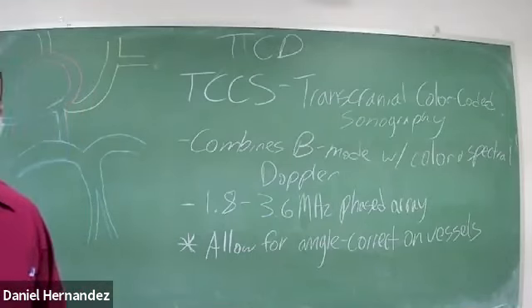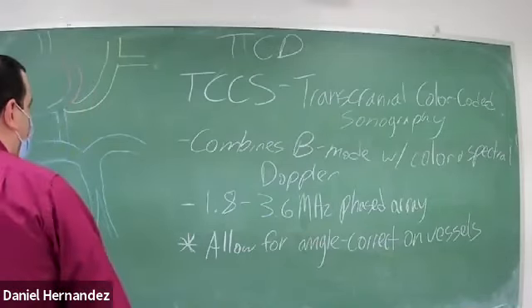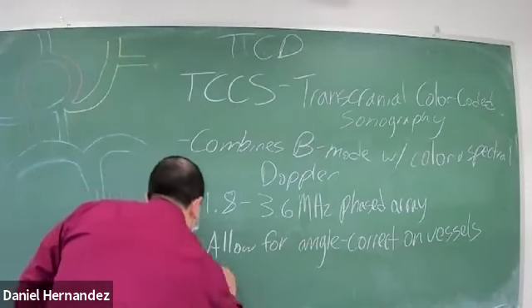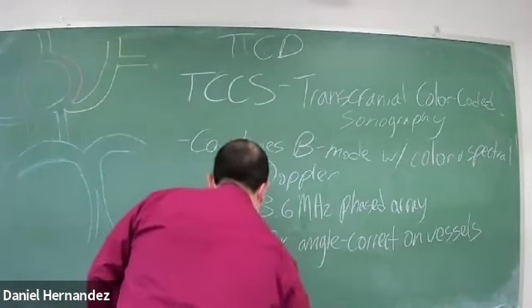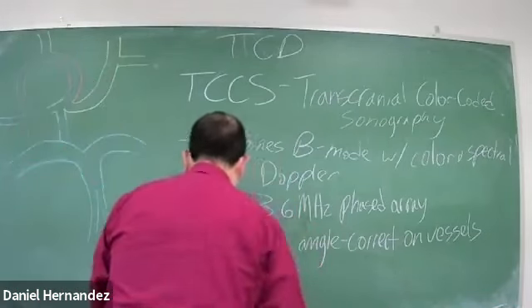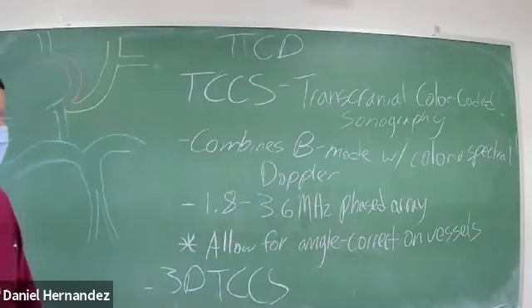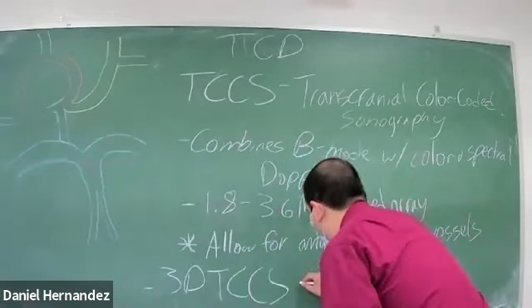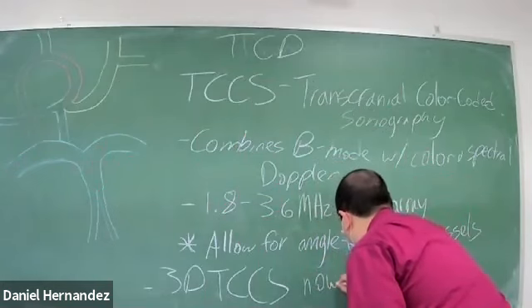With further advancement of technology, we are now able to do 3D transcranial color-coded sonography. That's now an option, now available.